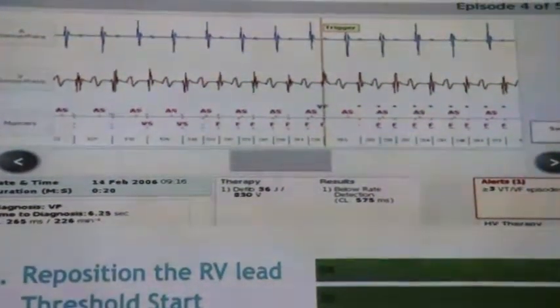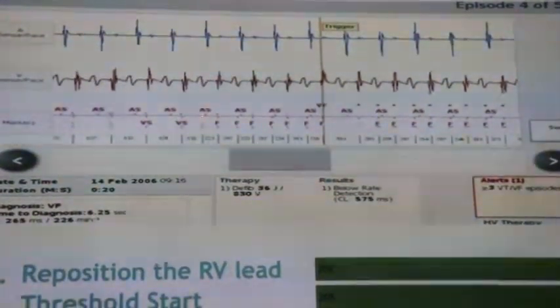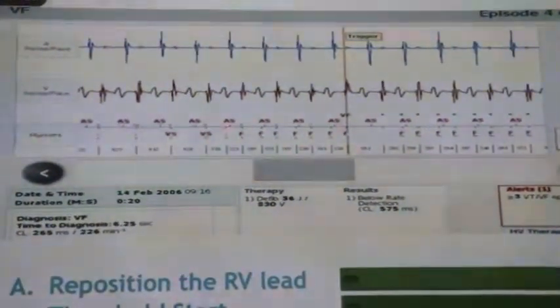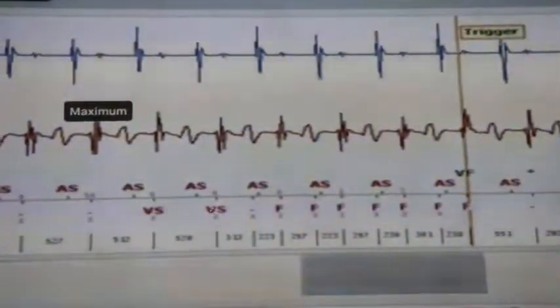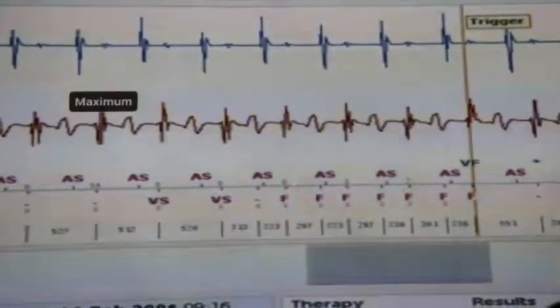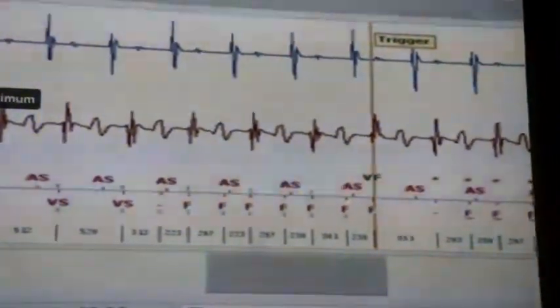He's sensing the P waves. Well, let's have a look. P wave, R wave, P, here, what is this? That's the normal P wave. This one here, the little marker before the A sense, can you see that? There's a little tiny marker. That's a T wave, most probably. T wave over sensing. R wave, T wave, R wave, T wave, R wave, classic T wave.